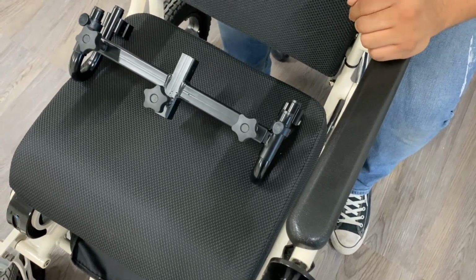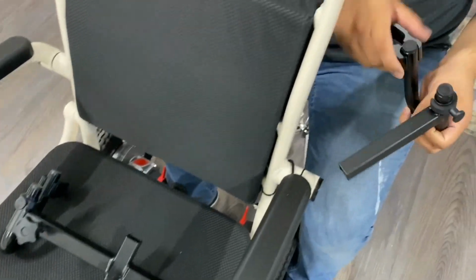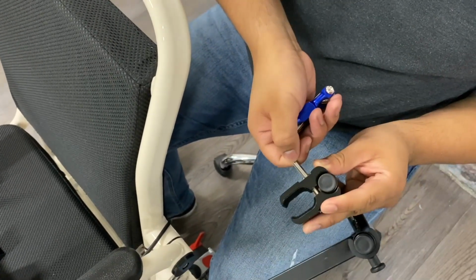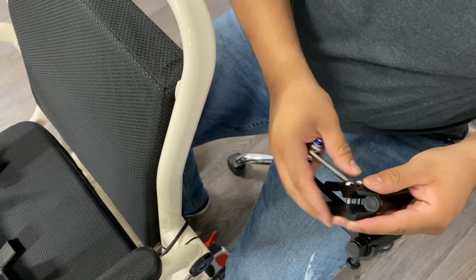Next, we're going to remove one end of the headrest. Undo the bolt, slide out the U-shaped piece. You're going to notice a little C-clamp on there. That comes already attached on your headrest, but you're going to loosen that up just enough to slide it off of this end U-shaped bar piece.